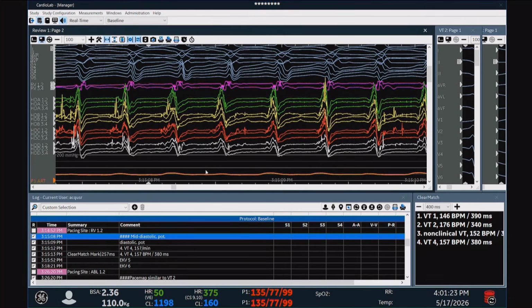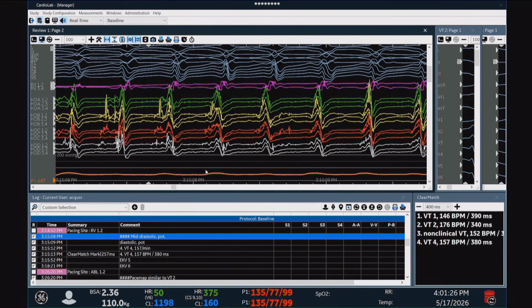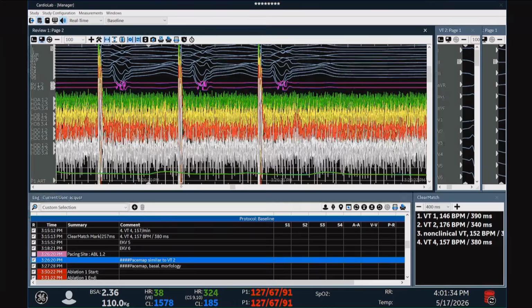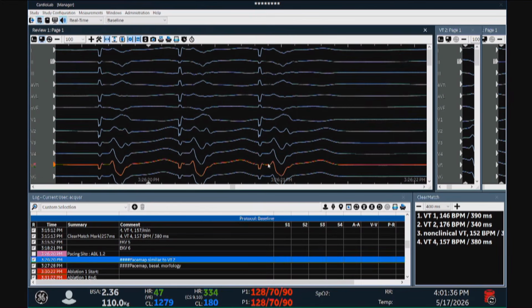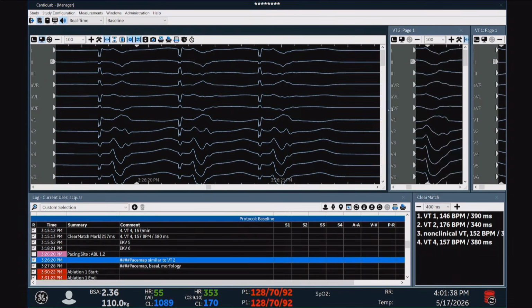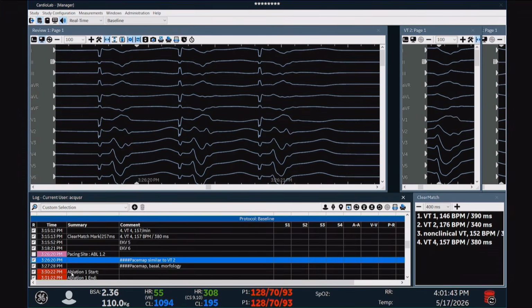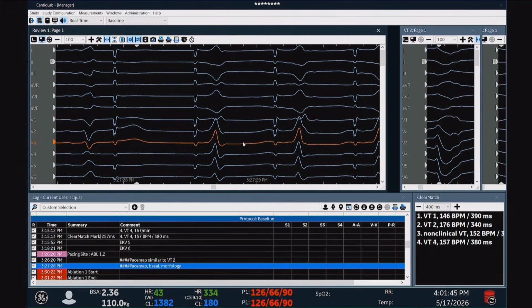This is some mid-diastolic activity, but the patient was not very stable. I was not very in favor of mapping anything during the VT. So we just moved to pace mapping, regionalized, looking at where the exit region would be for these two. They are not the same, but let's say this is the more lateral mid. And can we go to the other pace map that will have an even longer QRS, for the posterior septal, I would say, exit basal.